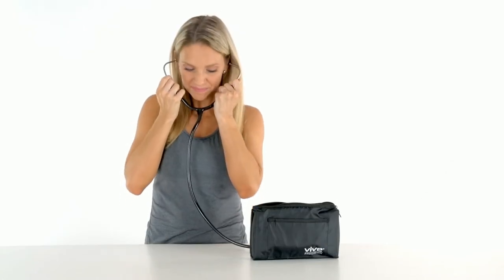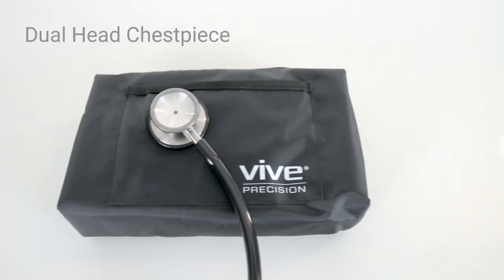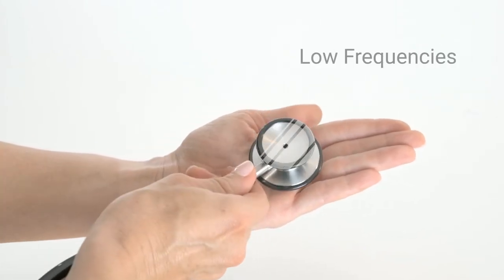The Stethoscope by Vive Precision provides exceptional clarity in a comfortable, lightweight design. Featuring a high-acoustic, dual-headed chest piece, the stainless steel diaphragm detects high frequencies, and the small bell detects low frequencies.